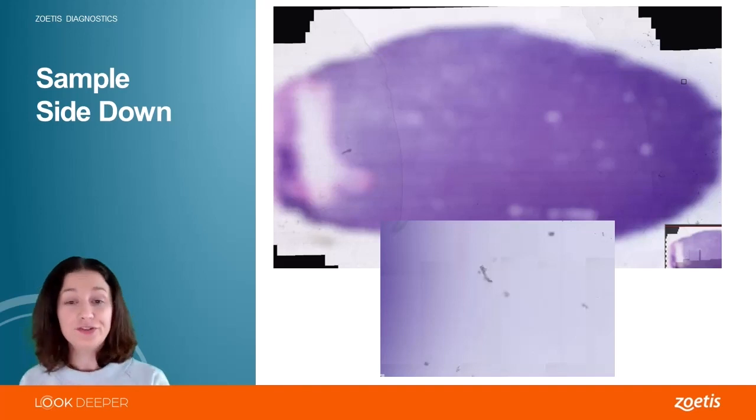This is another blurry sample, but this one I know for sure is upside down because what I have is a beautifully spread and beautifully stained sample that is unfortunately all out of focus. And I have a lot of junk that's in focus. So I can usually see the glass etchings on the reverse side of the slide, and I can see debris on the back side of the slide. So I know for sure that this one is upside down. This one's a quick fix. Take the cover slip off, flip it over, put the cover slip back on, and we're good to go.